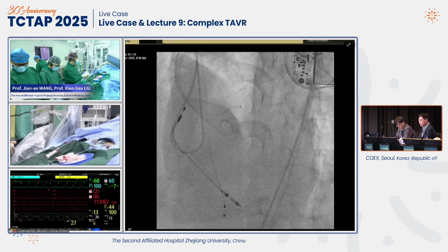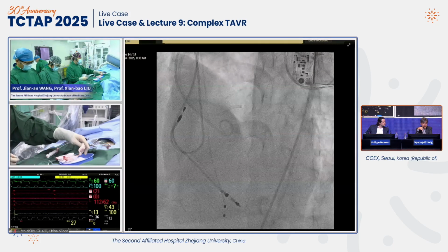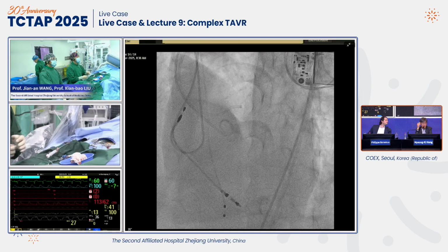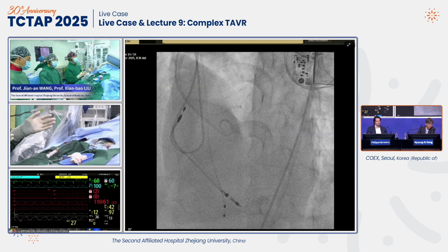May I ask what is the reason why this patient received a permanent pacemaker, and do you use a cerebral protection device in this patient? We will not use this. Because in our previous over 1,000 cases of BAV, the symptomatic stroke rate is quite low, similar to tricuspid.